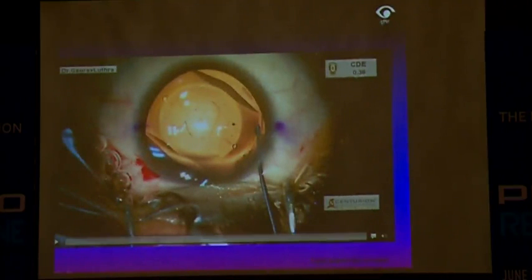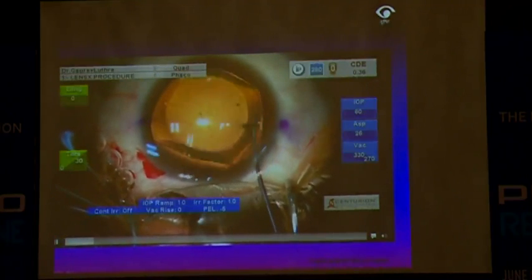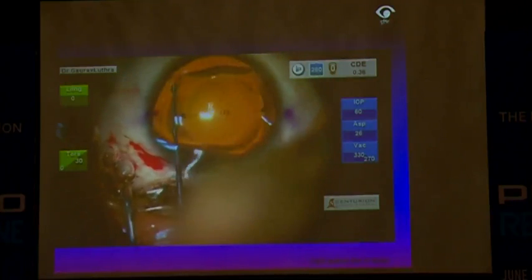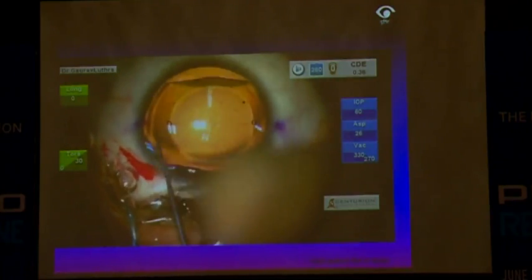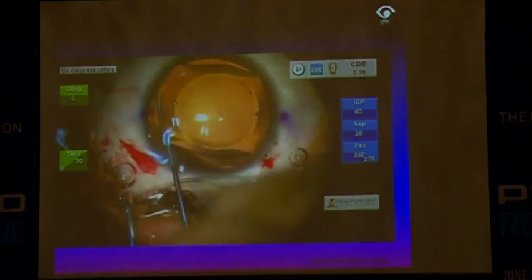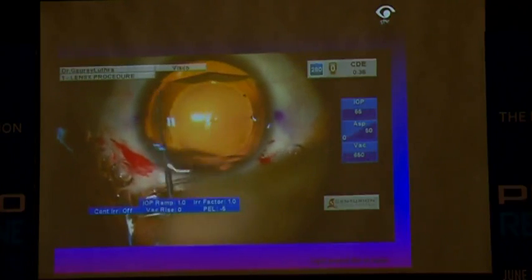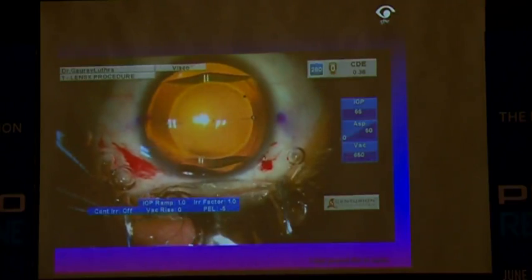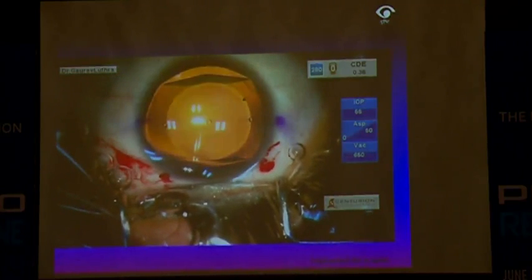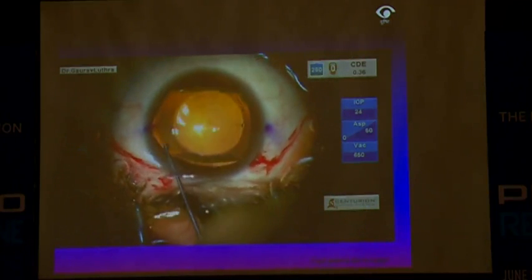Sometimes once you've injected the lens and you've put in the haptics nicely, it's fairly easy to do this. As long as your chamber is not overinflated with viscoelastic, there will always be enough space under the iris. So never let your chamber get overinflated. Then you can just tuck the haptics, and when you're fairly confident... in early days, we all ended up using pilocarpine to be sure that the haptics are nicely there and they're not tucked. But in the last few years, I don't use pilocarpine at all. We just leave it like this.